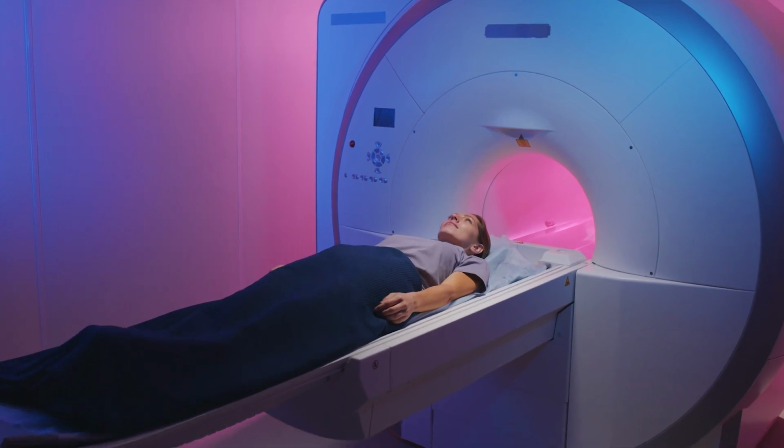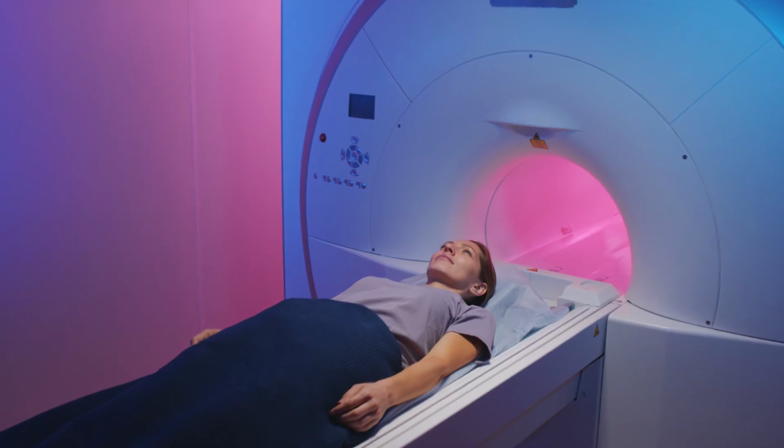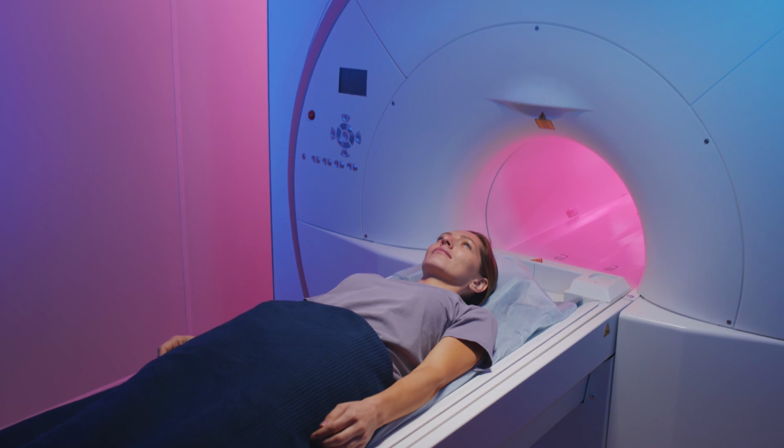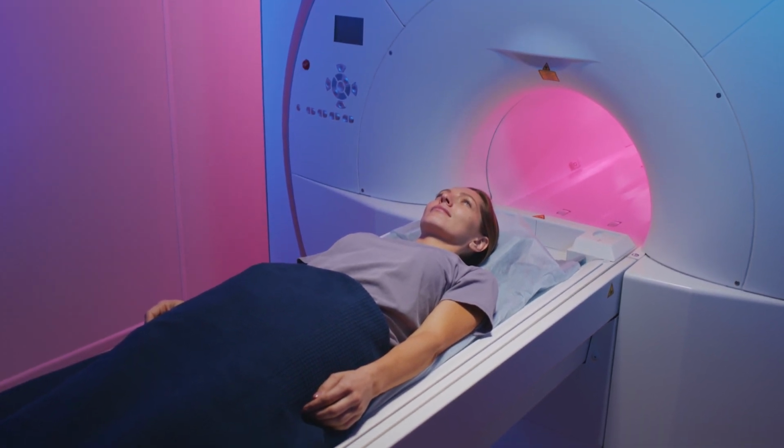Basically, MRI is a technology that uses very strong magnetic fields, and these magnets, MRI machines, are usually a few million dollars, and a big chunk of that money really goes to building very strong magnets. And these magnets can generate a very uniform magnetic field in an area the size of a large watermelon, where inside the scanner they put the patient's head or any other body part that wants to be imaged. And the uniformity of the magnetic field is really the magic of MRI. These magnetic fields are extremely uniform.